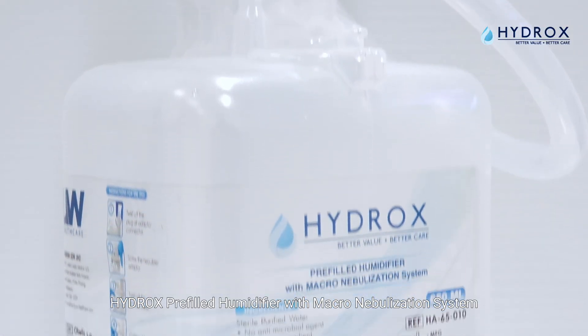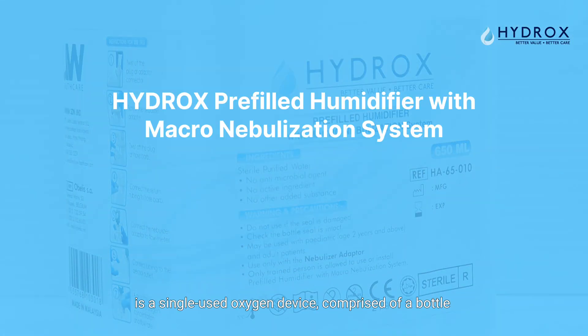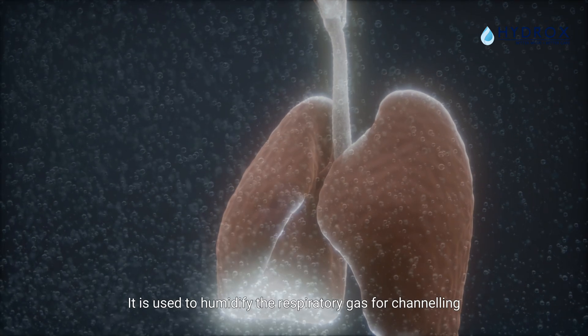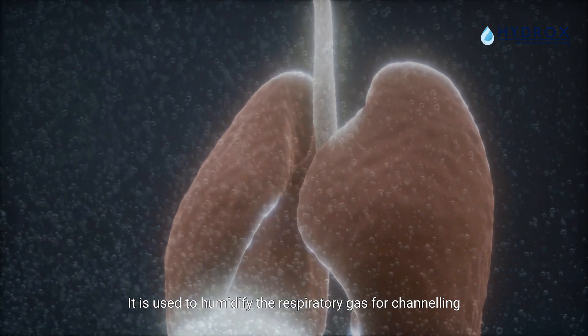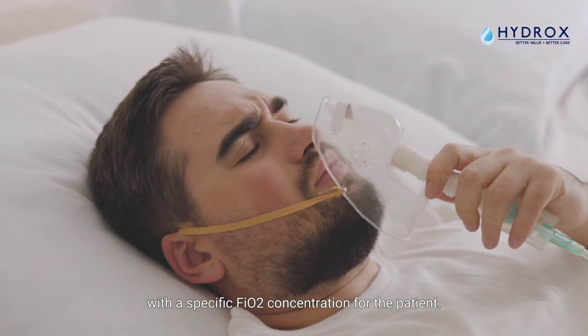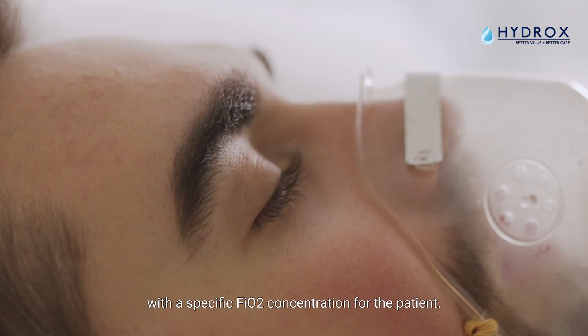The Hydrox Prefilled Humidifier with Macronebulization System is a single-use oxygen device comprised of a bottle filled with USP-grade sterile water and an adapter. It is used to humidify the respiratory gas for channeling to patients by producing a highly humid aerosol with a specific FiO2 concentration for the patient.